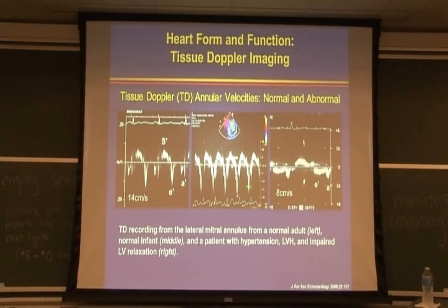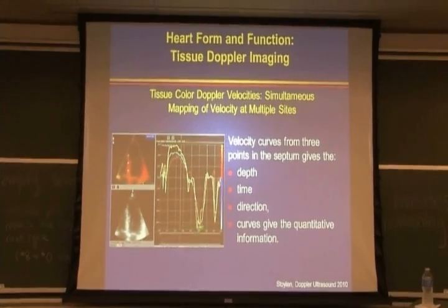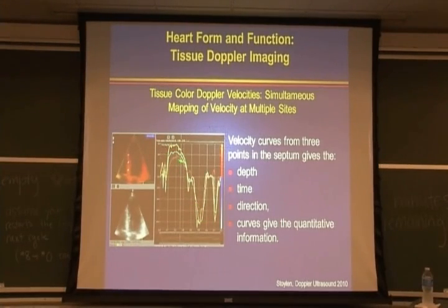So this gives an impression that there is a diastolic dysfunction. This is a myocardial velocity in a child where both early and late are almost fused and you can't discern that. So certain pattern recognition has provided some idea about how you can discern some myocardial disease. This is the same using the color Doppler, and we can sample the myocardial velocity at different points at the base, midpoint, and the apex, providing three systolic velocities and three diastolic velocities, early and late.